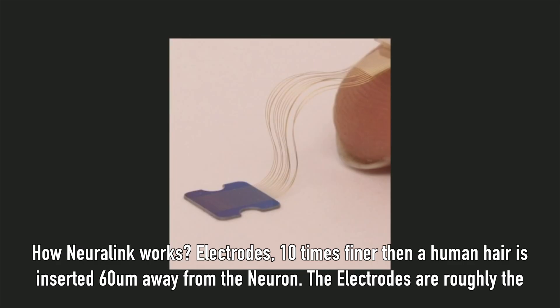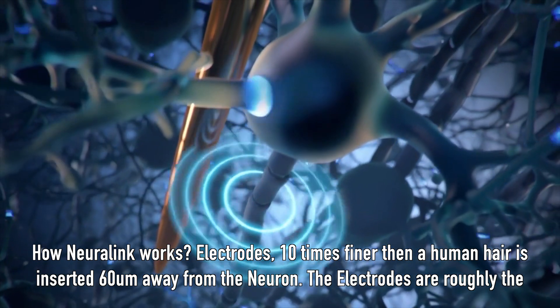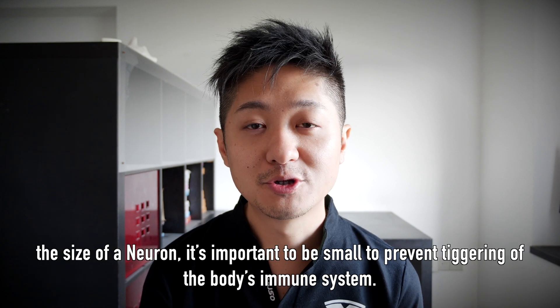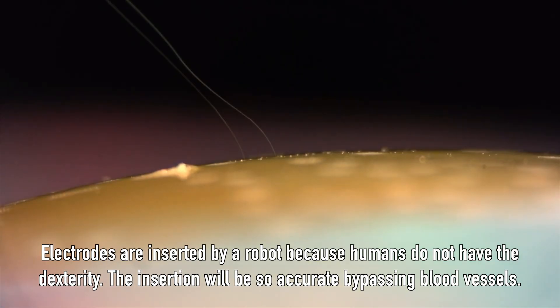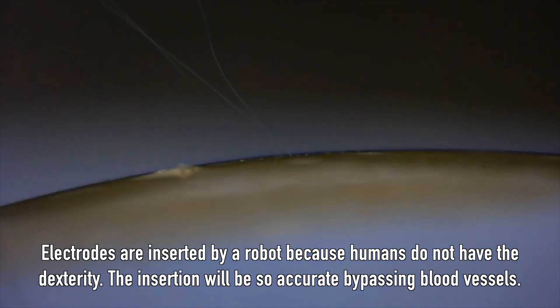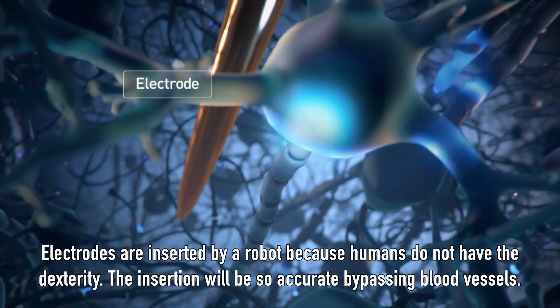An electrode 10 times finer than a human hair is inserted 60 microns away from the neuron. The electrode that goes next to the neuron is roughly the same size as the neuron. It is important to be small to prevent triggering the human immune system. The electrodes will be inserted by robots instead of humans because we humans don't have the dexterity. It will be so accurate it will be bypassing all major blood vessels.